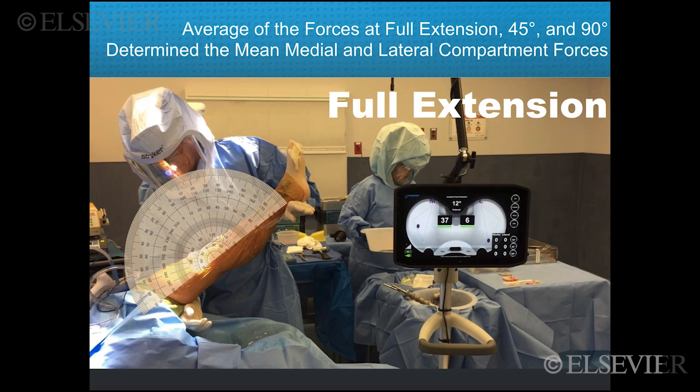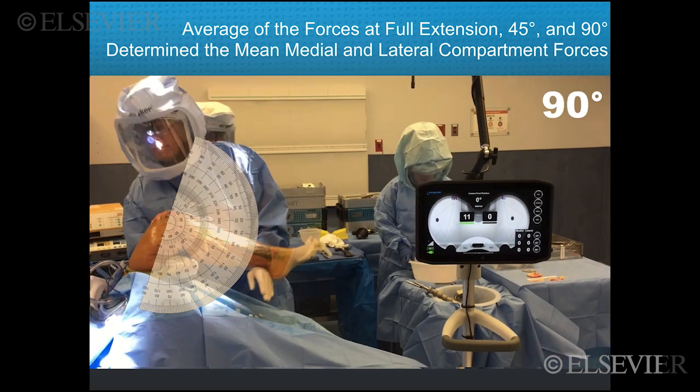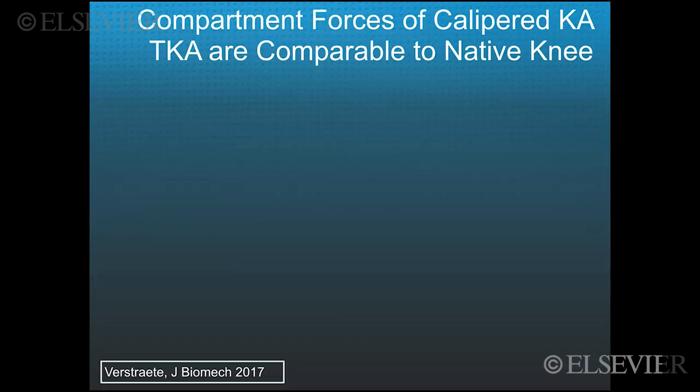So just to show you, at full extension, the medial force was 37, the lateral was 6. At 10, it was 21 and 6. At 45 degrees, it was 21 and 6. And at 90, it was 11 and 0. And so we average the 3 in each compartment and we get a force.